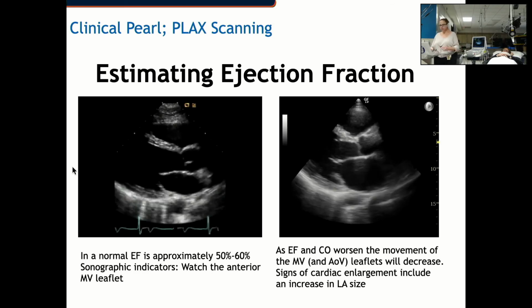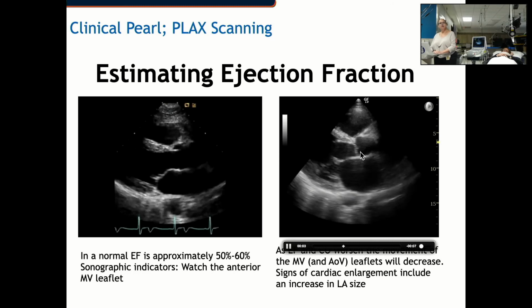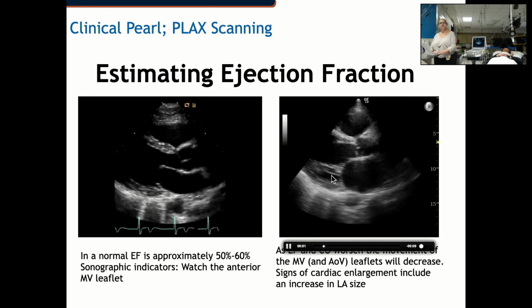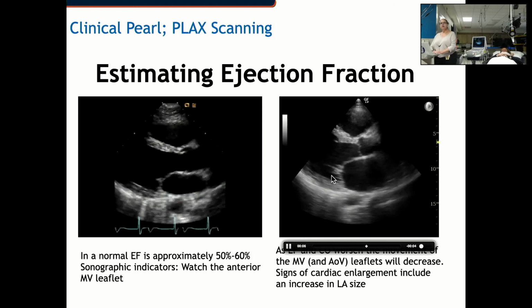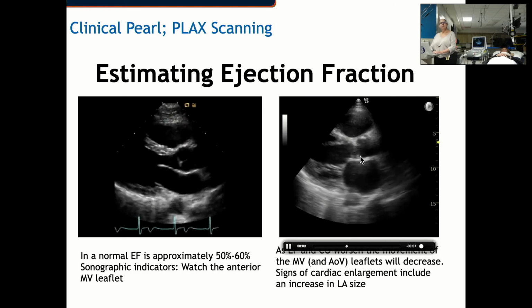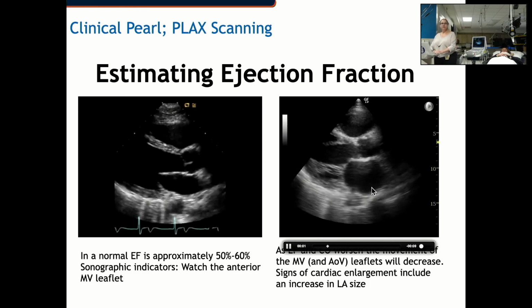But here on the right-hand side of the screen, you can see that the mitral valve and in turn the aortic valve both have a very limited opening diameter. They really have very minimal displacement as they open, and if you think about it, if blood can't get out of the left ventricle, then it can't escape the left atrium, and we often begin to see chamber enlargements here first, even before the right heart becomes involved.